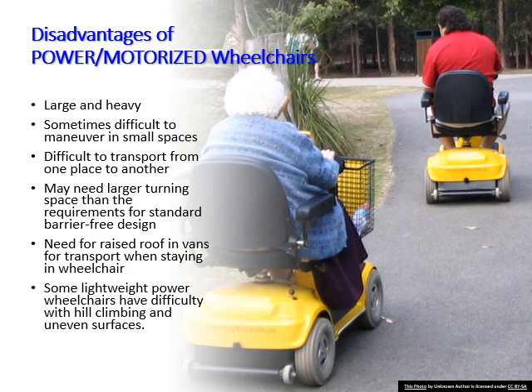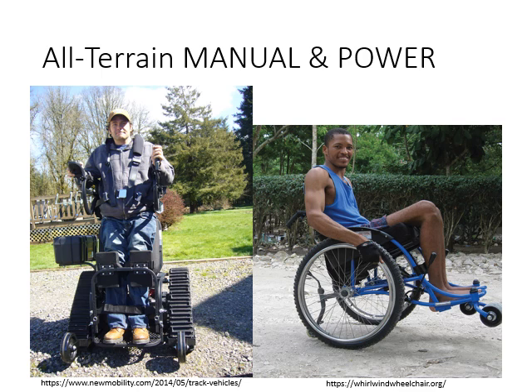And then some of the lighter weight power chairs, a lot of times we see them as scooters, have difficulty going up and down inclines and uneven surfaces, so that would be a difficulty. I'd like you to explore some of the videos that I have for you on some really cool technologies, different kinds of wheelchairs that you may or may not have seen.